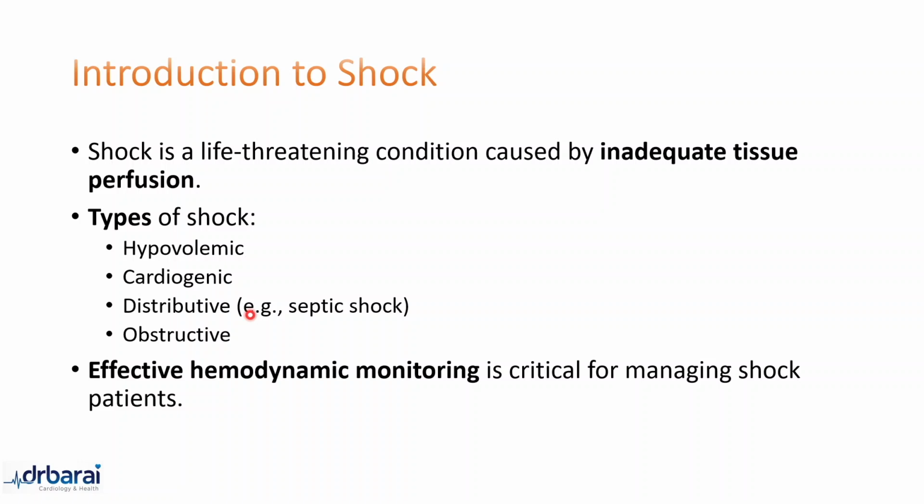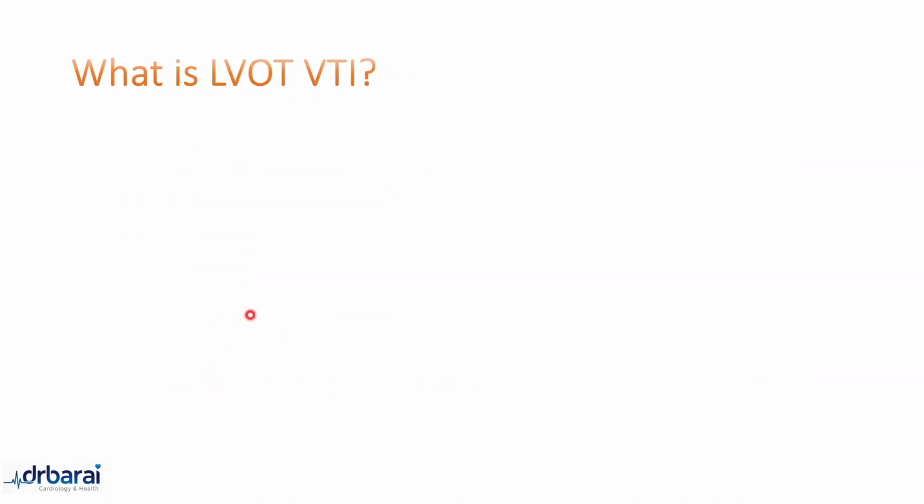One of the monitoring tools these days is the echocardiographic findings, especially the left ventricular outflow tract velocity time integral, or LVOT VTI. That is exactly what we are going to talk about over the next few minutes. So what is this LVOT VTI? This is a very important slide and I am going to repeat this slide again after some animations and some clips.